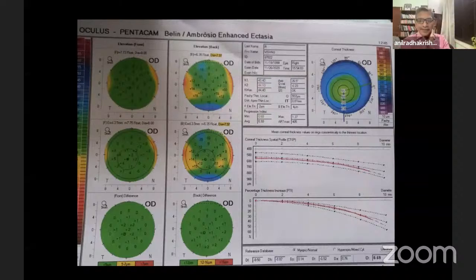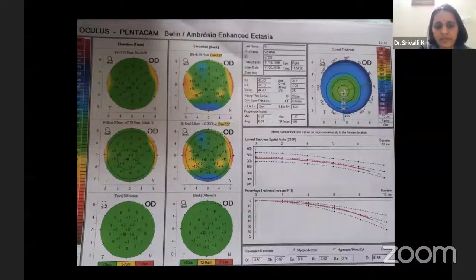Yeah. Thanks, ma'am. Along with all the other things that ma'am has just told, just to explain this once again, it's like zooming into one particular area. It's like there are 10 students, and if 8, 9 of them are getting 60%, and one of them gets 99%, if you just take an average, then you are actually missing to see who has got the higher score, right? So you want to see that one person who has got a higher score. It's like that ectatic point. So if you just exclude that one person's score and take the rest of the average, then that person's score would stand out. You understand? So it's that way of doing it.